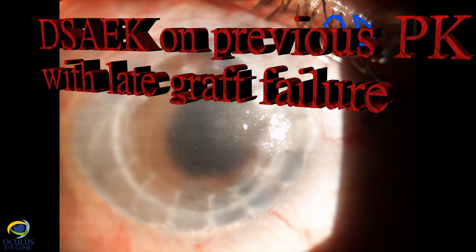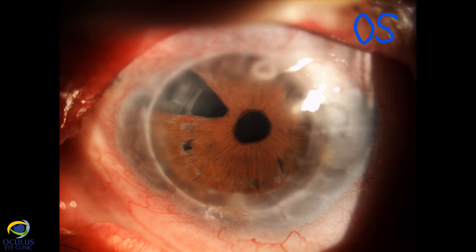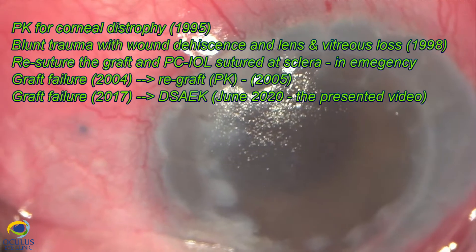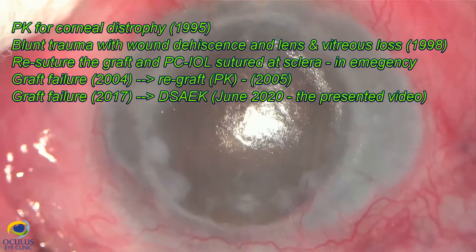I'm Dr. Rosana Moraru and I'm going to present a case of a 45-year-old male patient who had penetrating keratoplasty in both eyes 20 years ago for corneal dystrophy. The left eye still looks okay, but in the right eye, unfortunately, he had blunt trauma with wound dehiscence, lens expulsion, and vitreous loss.